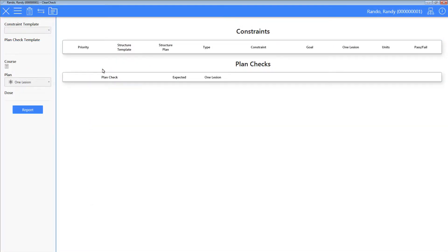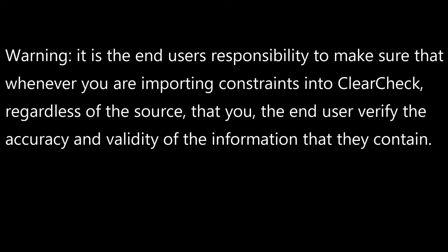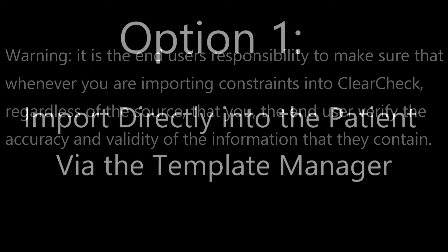Now we are ready to import the constraint template into ClearCheck. It is the end user's responsibility to make sure that whenever you are importing constraints into ClearCheck, regardless of the source, that you, the end user, verify the accuracy and validity of the information that they contain.